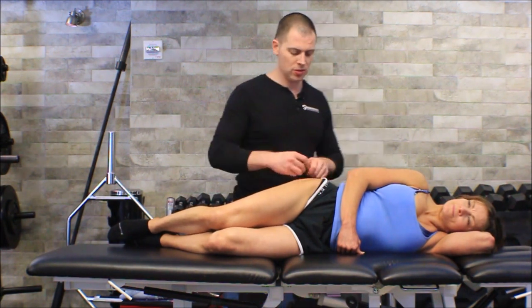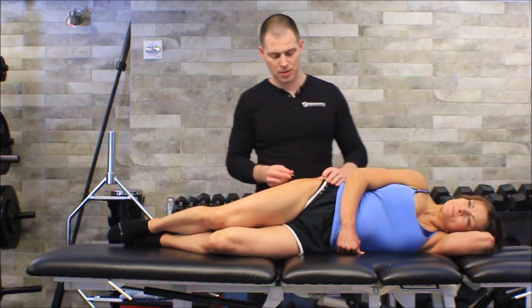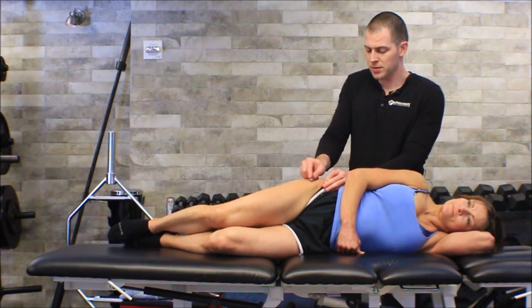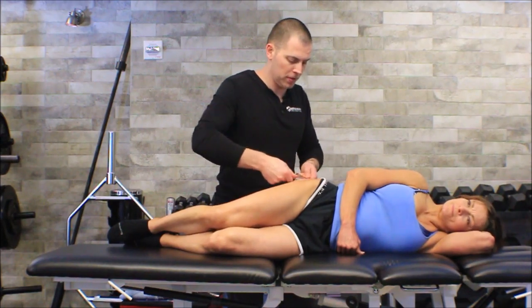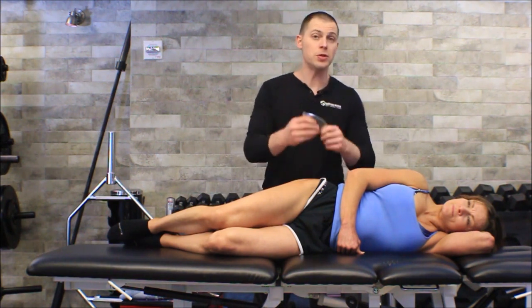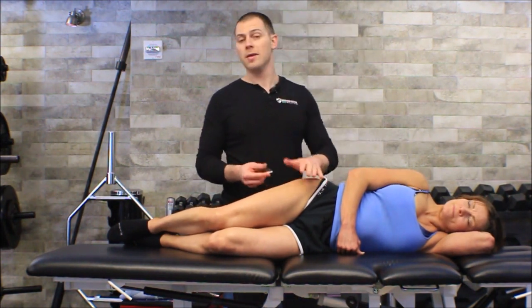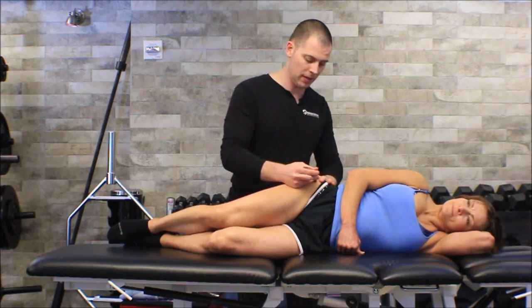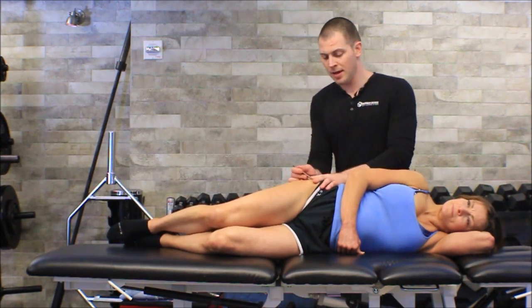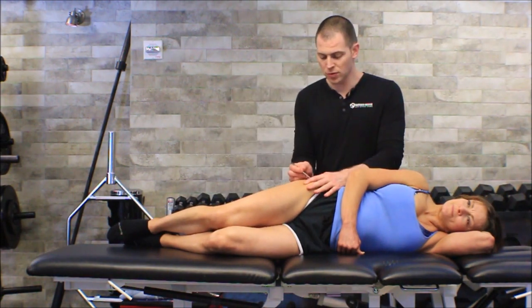Again I'm thinking the same thing — just strokes in a few different directions, some little sweeping strokes, keeping the tool at about 30 degrees, and just pulling through or pushing through in a few directions to get everything broken up. Now we went over the TFL as if going over the fascial layers, but let's say I had a trigger point in the TFL noted during manual techniques. I could use the end of this shark fin tool to break up any adhesive tissue that had formed around that trigger point. I do find that helps with carryover — it helps desensitize those trigger points a little faster.